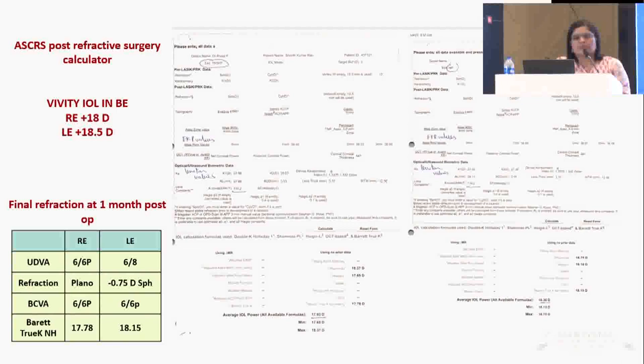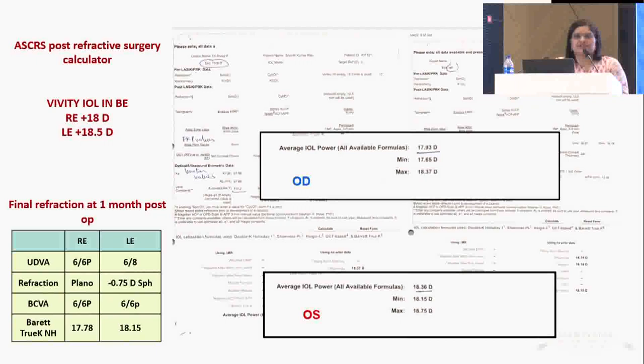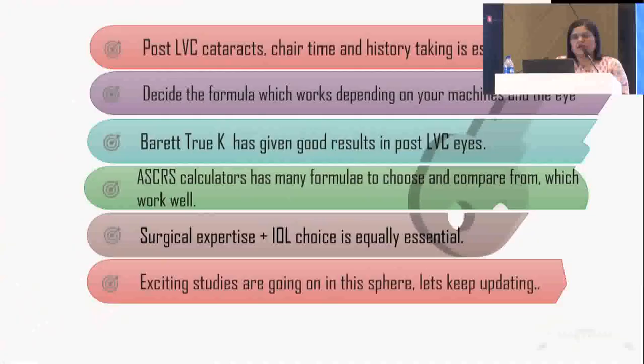So probably this explains what we have been talking about till now, how small little changes can make a difference to the patient's vision. So the take-home message for this talk is that in post-LVC cataract, chair time and history taking are essential. We have to decide which formula will work depending on the machines that you have. Barrett True-K has given good results in post-LVC eyes. And ASCRS calculators are also equally good, with many formulae to choose and compare from, and they work well. Surgical expertise with IOL choice is very important, and exciting studies are still going on, and we are still learning every day. Thank you so much.